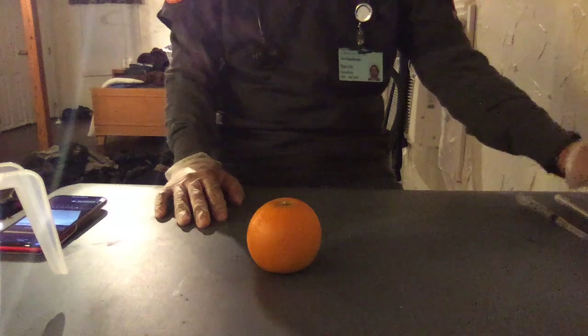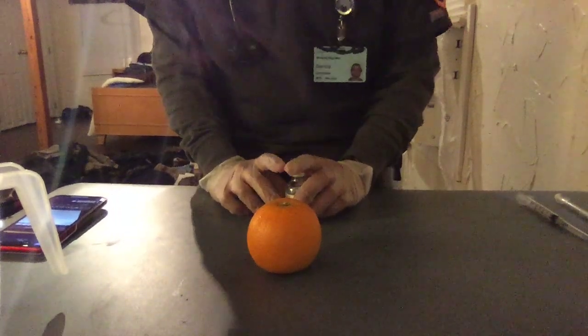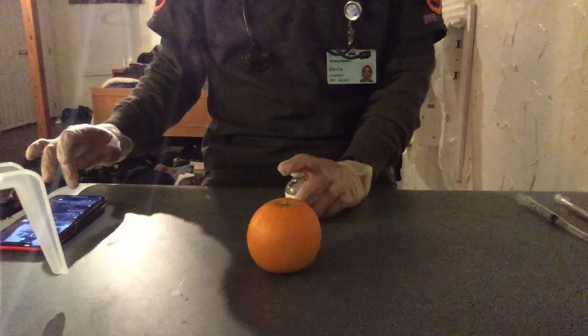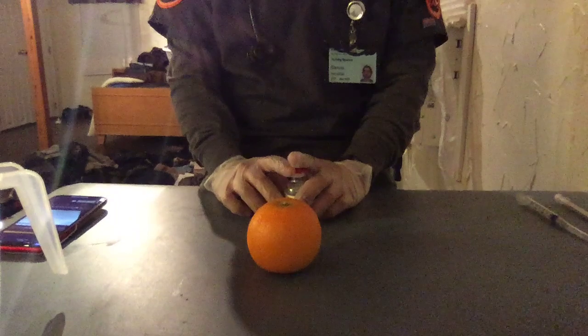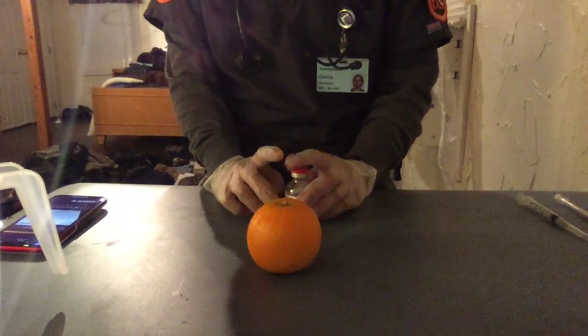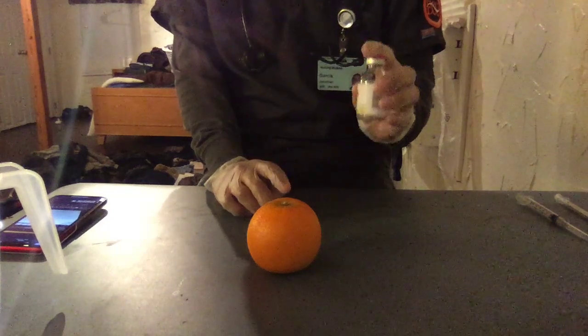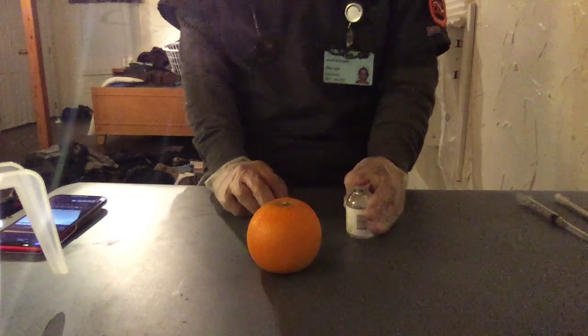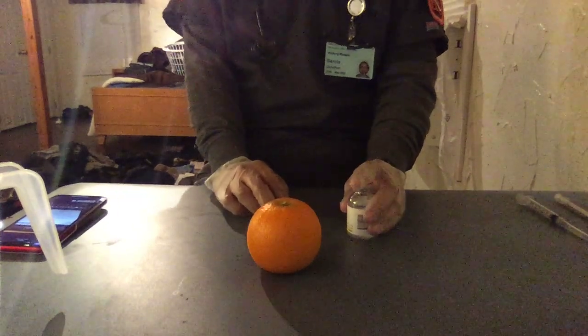So patient name is Sally Smith. Today is April 26th, and we'll say it's noon, 12:26. 1.5 milliliters of saline to be given intramuscularly one time now.